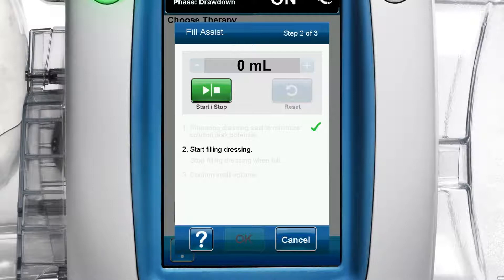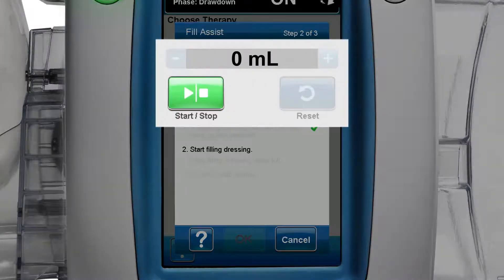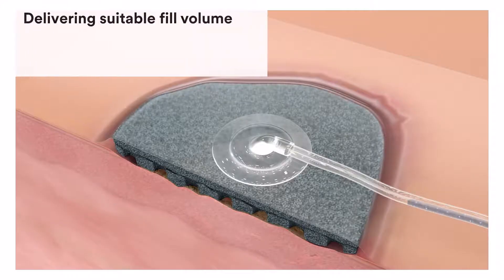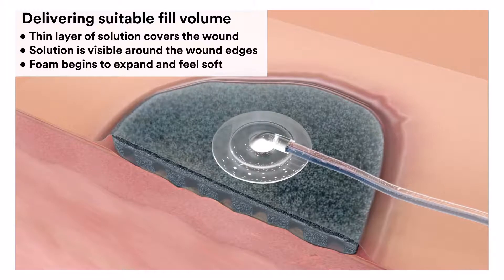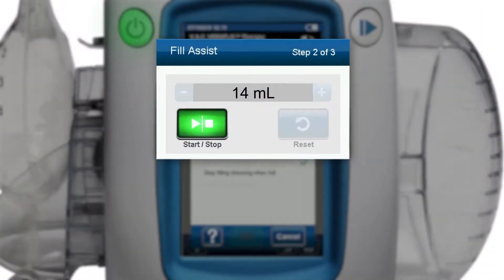Start filling dressing. On the fill assist step 2 of 3 screen, press the green start/stop button to begin delivering solution to the wound. Monitor the wound as it fills with solution. Once a thin layer of solution covers the wound, is visible around the wound edges and the foam begins to expand and feels soft, press the start/stop button to stop filling.